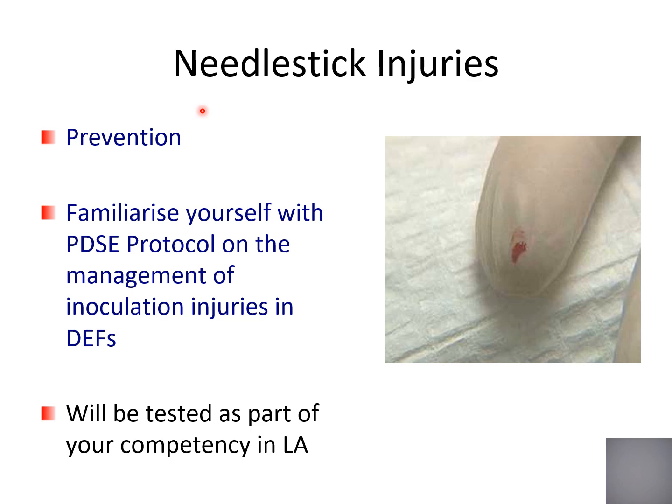Administration of local anesthesia in clinical environments carries a recognized risk of needle stick injuries, and your focus should really be on prevention of these injuries in the first place. Safe and appropriate use of the Safety Plus syringe, as is practiced in the dental education facilities, reduces this risk to negligible levels, and unless you're really careless, you should not encounter any needle stick injuries.